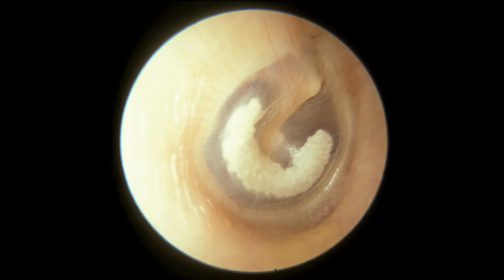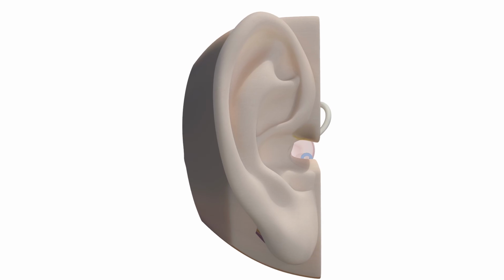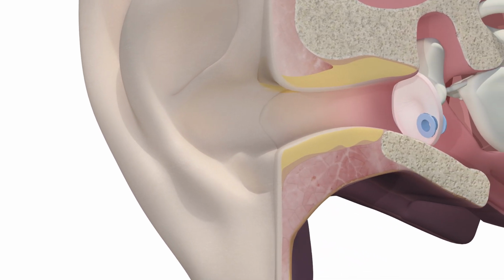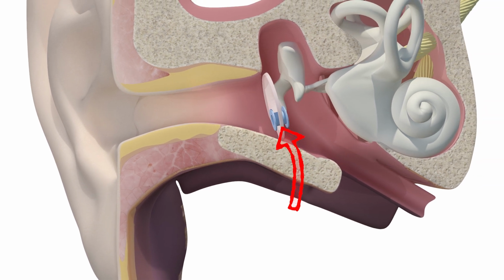And when people would look in my ear, they could see scar tissue from actually when I had ear tubes when I was 2 years old. Tympanostomy tubes, also known as ear tubes, are devices that are placed frequently in children, but also in adults, under conditions of recurrent ear infections, and that is to evacuate fluid that's stuck behind the eardrum or to ventilate the ear in order to prevent recurrent infections from taking place.